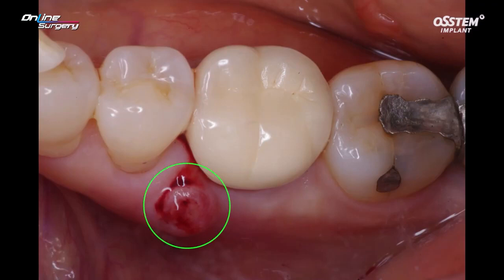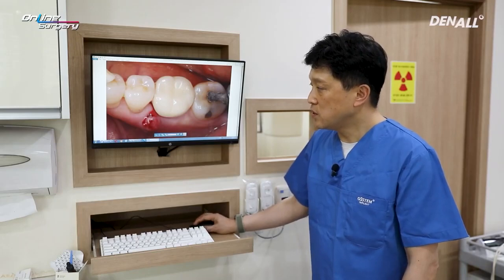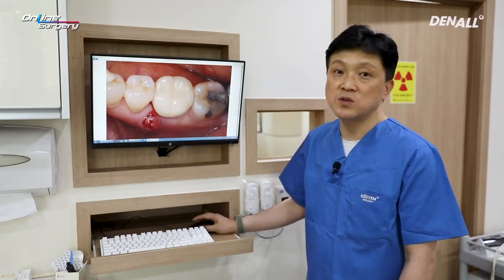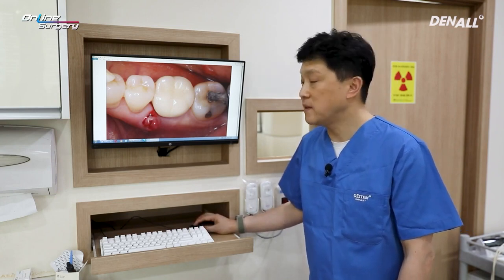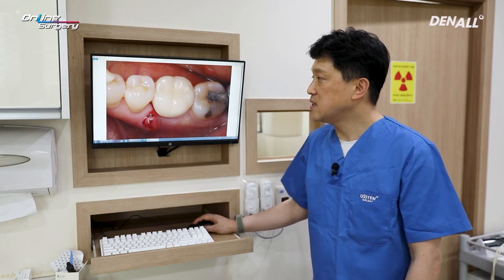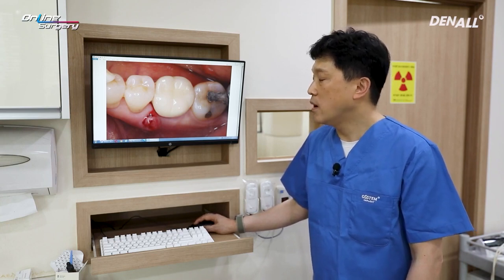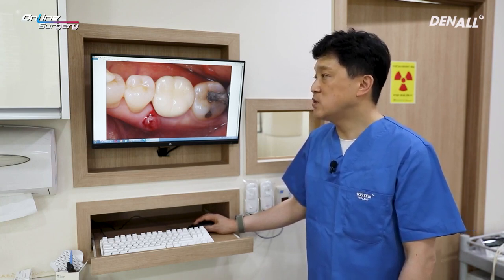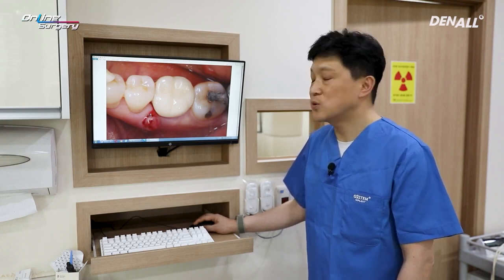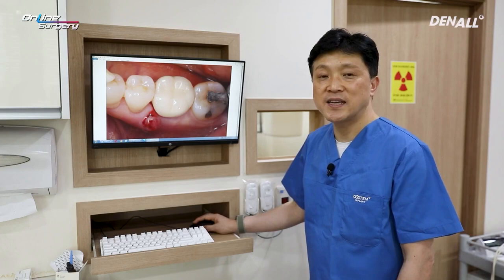If you look at this image, on the mesial side, there's gum boil and fistula tract. In this area, on the mesial side, there can be fenestration or dehiscence defect. There's high possibility of that. The surgical video is about doing extraction in number 46 and performing immediate implant placement as well as transmucosal GBR.